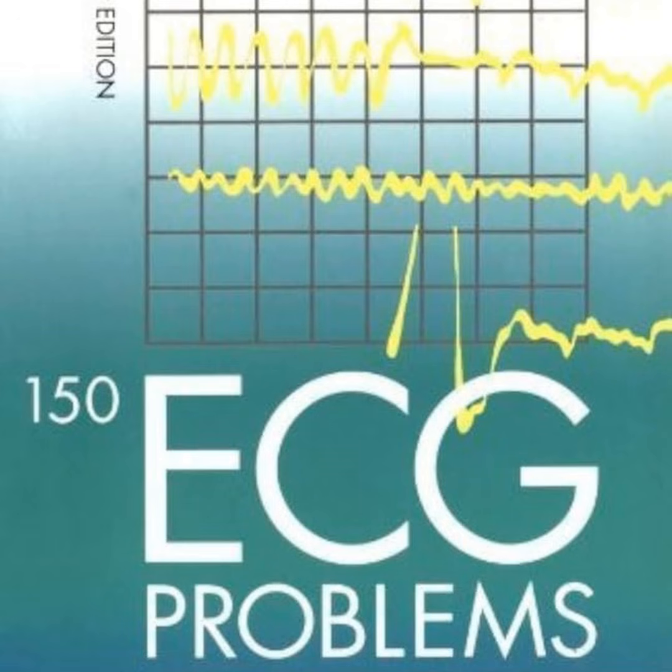Consider this. You've got a 25-year-old pregnant woman presenting to your clinic, and she's complaining of palpitations, just this sort of irregular heartbeat. Pretty common presentation. Very. And on auscultation, you note a soft systolic murmur, but the rest of her cardiovascular exam is otherwise totally unremarkable. You pull an ECG, it shows sinus rhythm, a normal axis, normal intervals, but she has these frequent ventricular extrasystoles. Now, I feel like your immediate instinct when you see those early, wide complexes popping up might be to intervene. Right, because you see an arrhythmia and you want to fix it.